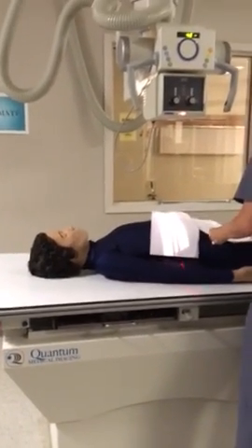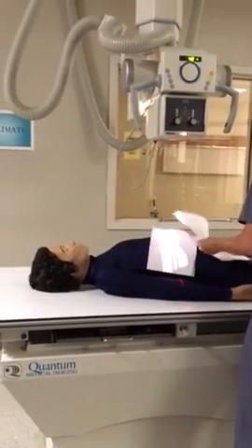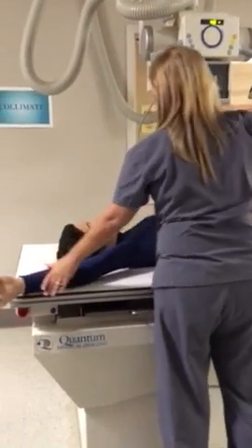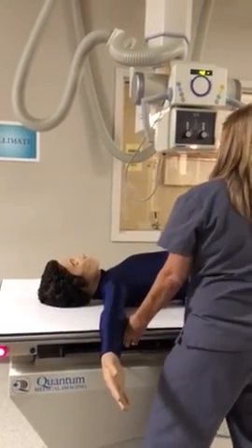Standing up. We'll get that one. Hopefully we'll get that one. Get that up there. Okay, AP scapula. And the arm has to come up to pull the scapula away from the body.